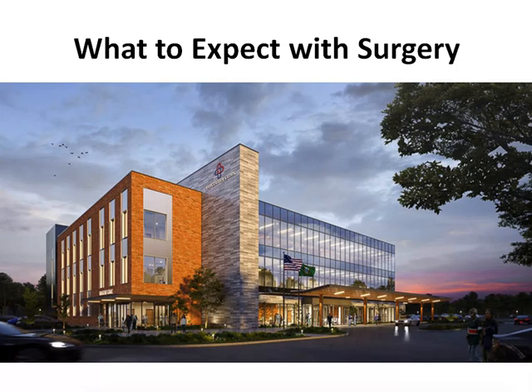Even though it's normal to feel nervous leading up to the surgery, the IV sedation will make you comfortably relaxed during the actual surgery. Most patients are pleasantly unaware that their surgeon is working on their eye. You should not have any pain during the surgery itself. The conscious sedation has a rapid onset and is similar to what most patients receive during a colonoscopy. An eye shield will be placed immediately after the surgery. From check-in to check-out, most patients spend 2 to 3 hours at the surgery center.